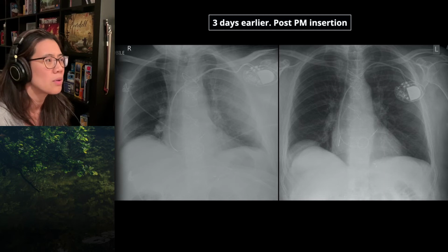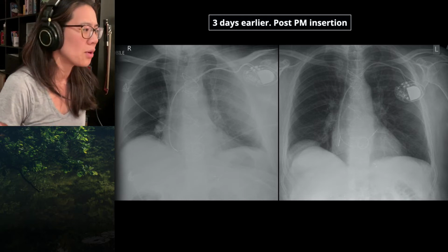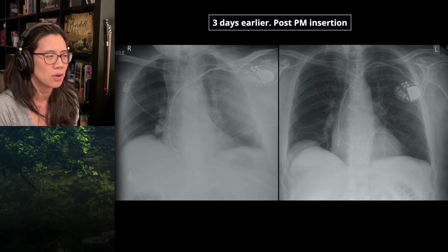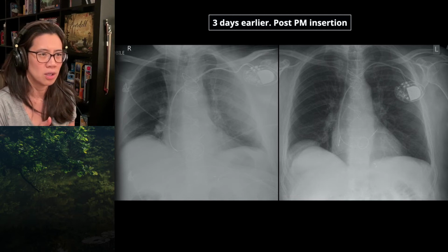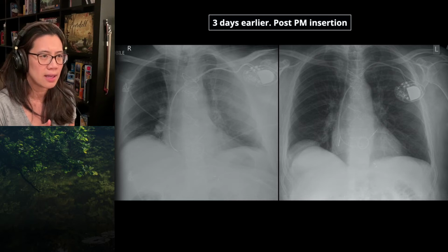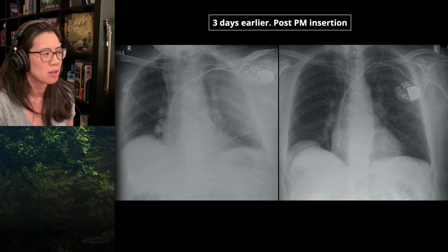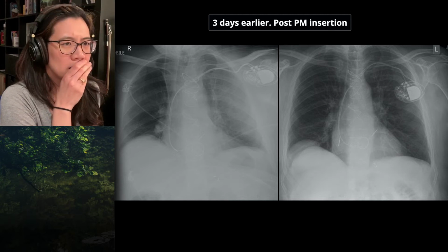Oh, now hold on. So I've got the x-rays. Sorry, the x-ray on the right is the first one. Yep. So something's happened to that pacemaker. The chest wall component is in a completely different position to the initial chest x-ray, and the leads are now sitting differently. The atrial lead is flipped around. It was doing a U-turn. It's now going straight down. Yeah. So you have the next slide now.